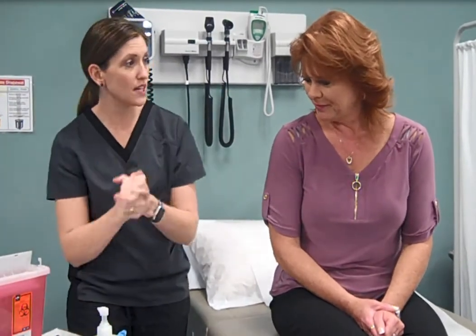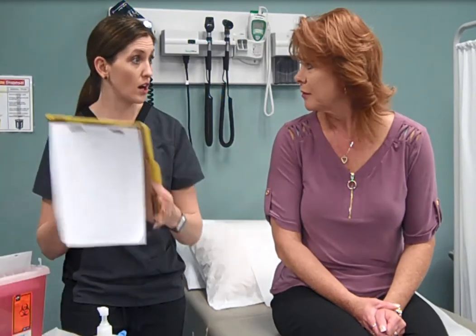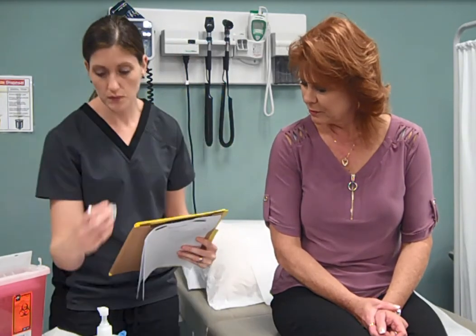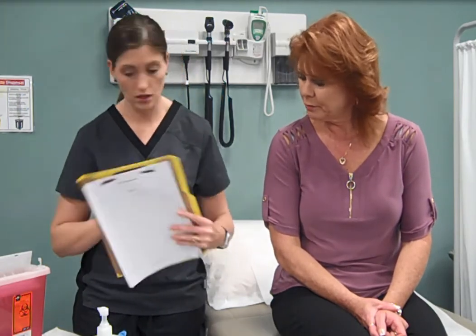This video will show you how to administer an intramuscular injection. Wash hands and introduce yourself to your patient. Identify your patient and explain the rationale for the performance of the procedure. Allow your patient to ask any questions and verify the medication with your patient.